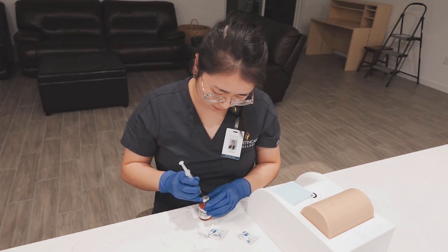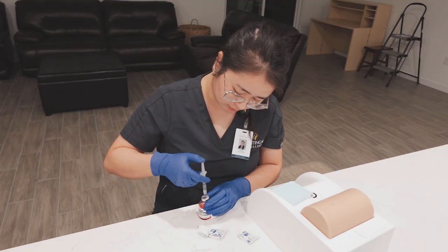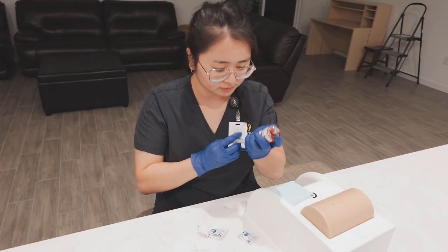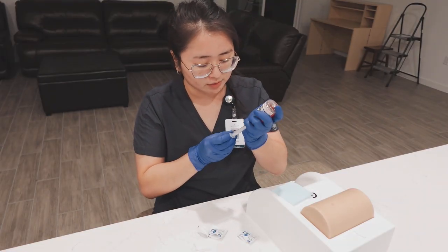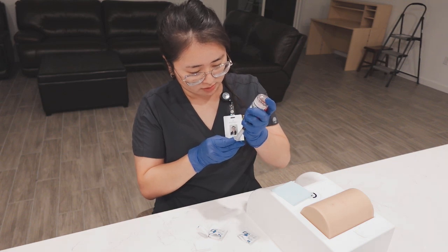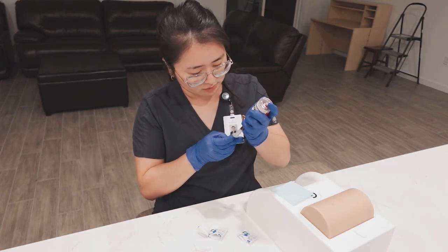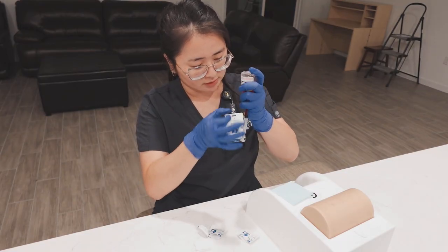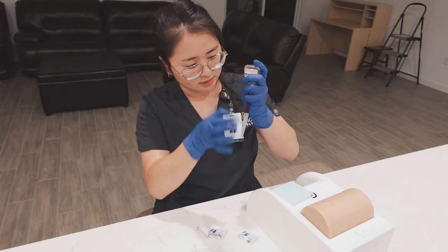put this medication. We're going to inject the air into the vial, invert the vial, and I want to make sure I'm looking at the correct units. All right, we're going to make sure that it is at 1.5 milliliters, and I see some air bubbles.